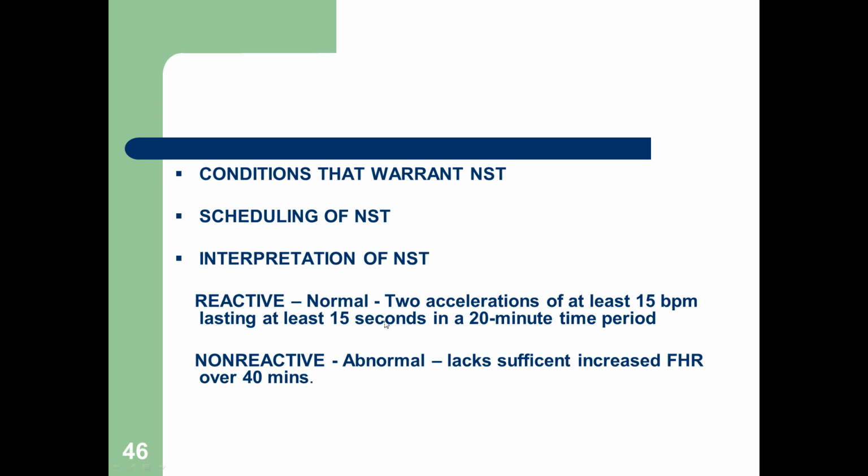So you want to see two good accelerations of at least 15 beats above their baseline, okay? We want it to last at least 15 seconds in a 20-minute period. So a normal reactive non-stress test wouldn't take much more than 30 minutes. Non-reactive, there's lack of sufficient increased fetal heart rate over 40 minutes, okay?